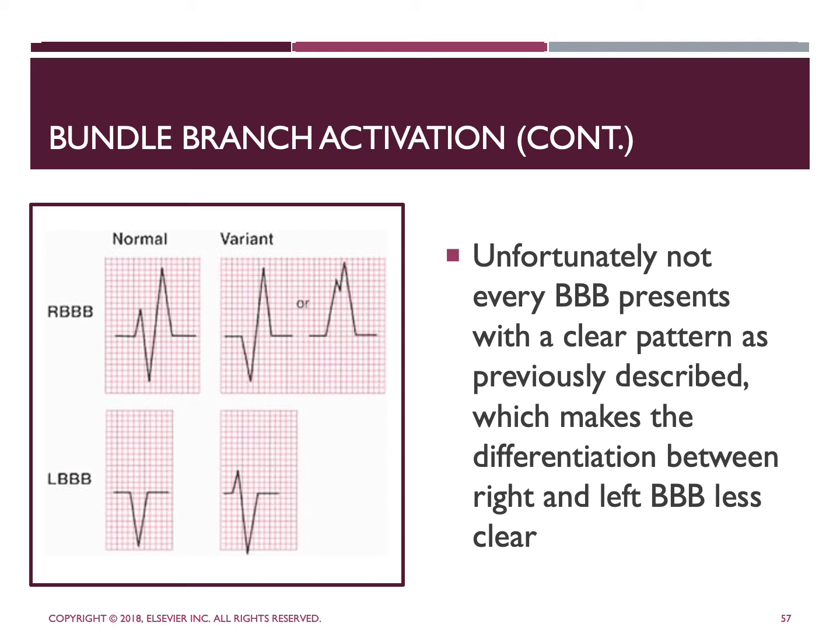So what you're looking at here are just different variant patterns of bundle branch blocks as we would see them in lead V1. And much like this says, unfortunately, everything that I just described in the previous slides about bundle branch blocks, not every BBB is going to present with that same clear pattern that I just described, which makes the ability to differentiate between right and left bundle branch block a lot less clear and can make it a little bit difficult.